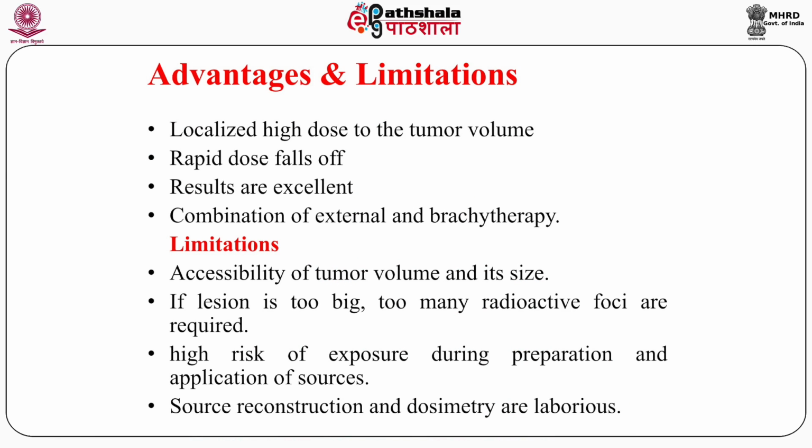Advantages and limitations of brachytherapy: the advantage is a localized high dose to the tumor volume. Since the radioactive source is placed very close to the tumor, the dose to the tumor region or tumor volume is very high. And in brachytherapy, the dose reduces very sharply with distance.